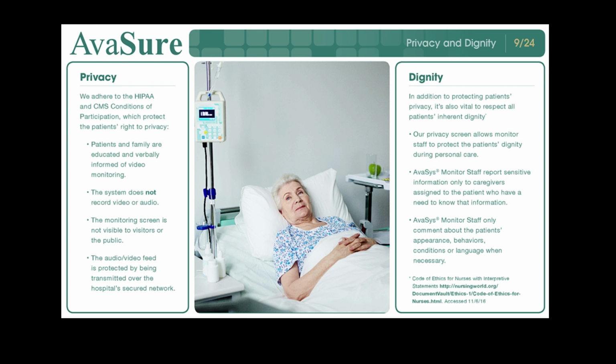To adhere to the HIPAA and CMS conditions of participation, which protect the patient's right to privacy, we make sure patients and family are educated and verbally informed of video monitoring. The system does not record video or audio. The monitoring screen is not visible to visitors or the public. The audio-video feed is protected by being transmitted over the hospital's secured network.